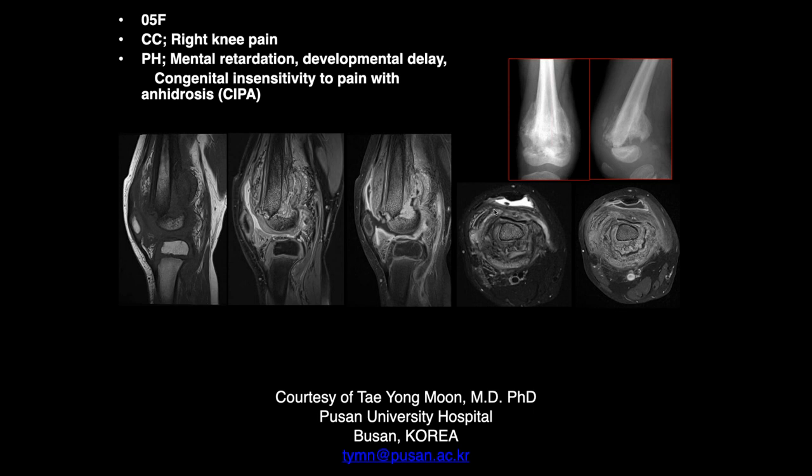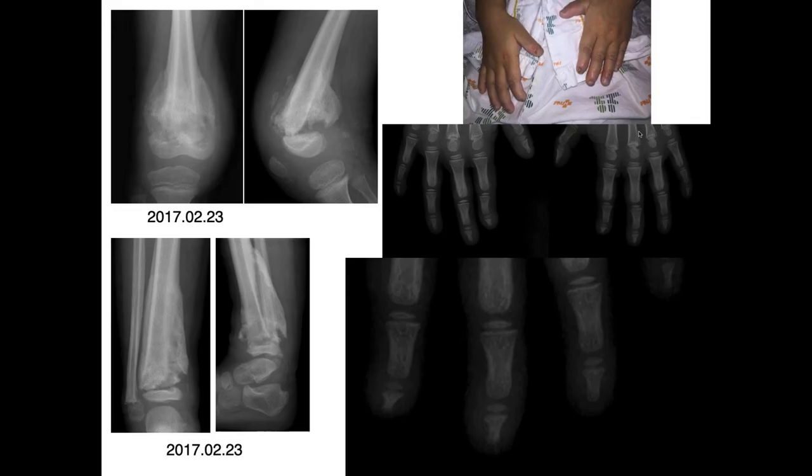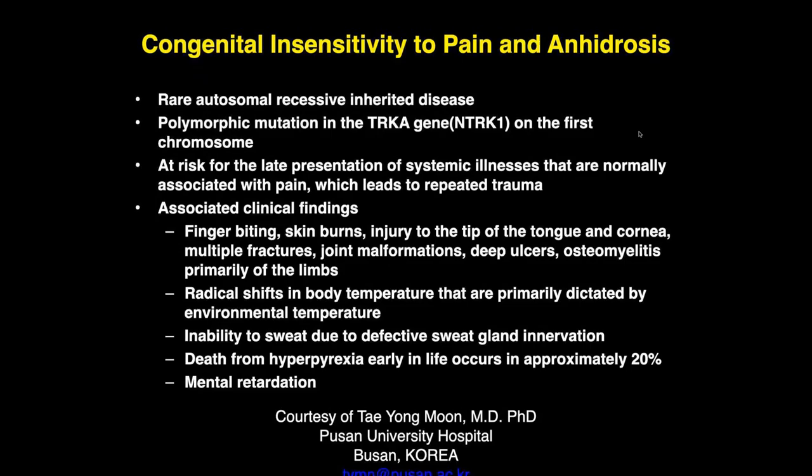it looks like this is a chronic fracture of the physeal plate. Like it's dislocated. There's a lot of surrounding soft tissue edema, swelling, like marked. And then there's also bony changes that you can see. So it's definitely chronic, and with insensitivity to pain and developmental delay, she's just probably not feeling it. This is like just a big chronic Salter-Harris fracture.